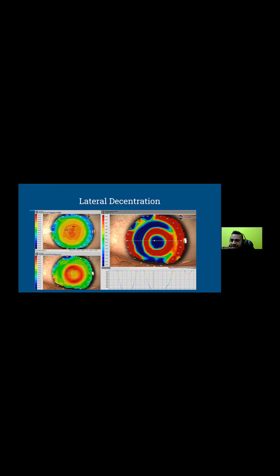Well, next thing I'm looking at is this blue area where the Ortho-k design should really align. I'm doing pretty good here. Whoa, what's happening on this side? I'm not landing appropriately. So I could easily convince myself without looking at a fluorescein pattern. I could say, well, what's happening here on this side is I am too steep. I'm not landing on the cornea. I need to get closer to the cornea in the Ortho-k design to get a nice 360 blue ring.